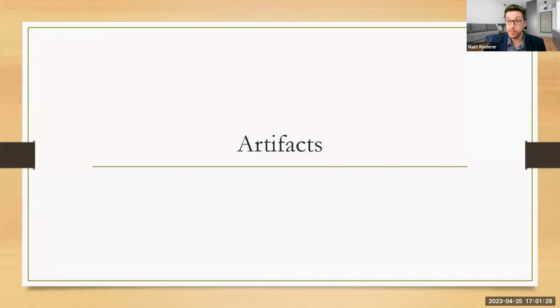Metal. Yep, something clouding or distorting the image, absolutely. Something unwanted, yeah, an unwanted effect on our image, perfect. It's all of the above. It could be an implant, it could be a device, it could be something that is not supposed to be on our image. It could be a distortion from the equipment, it could be a bunch of different things, undersampling of our image. So absolutely.